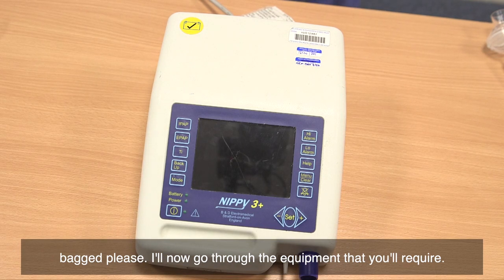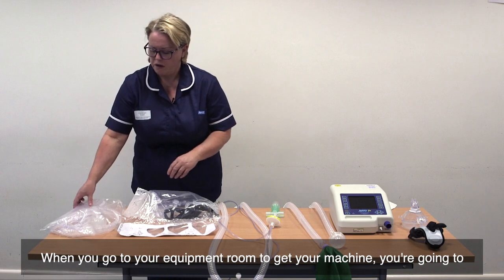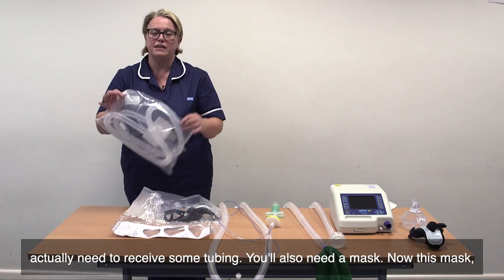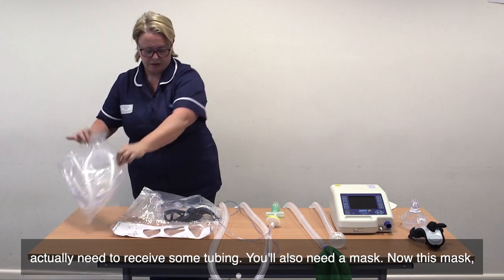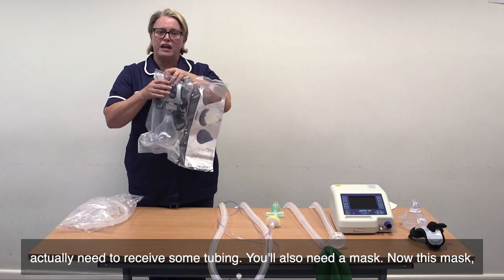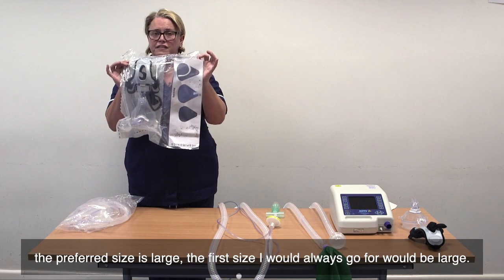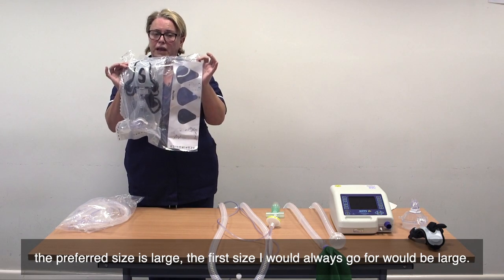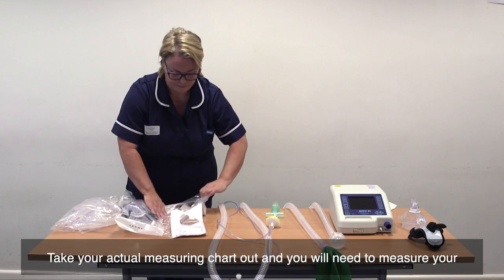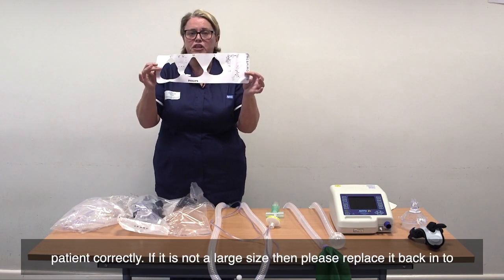I'll now go through the equipment that you will require. When you go to your equipment room to get your machine, you're going to need some tubing. You'll also need a mask. The preferred size is large — that's the first size I would always go for. Take your actual measuring chart out and you will need to measure your patient correctly.